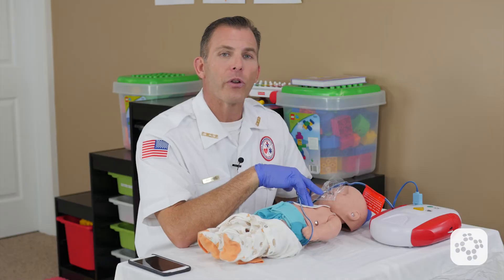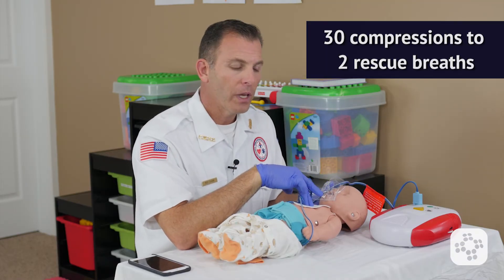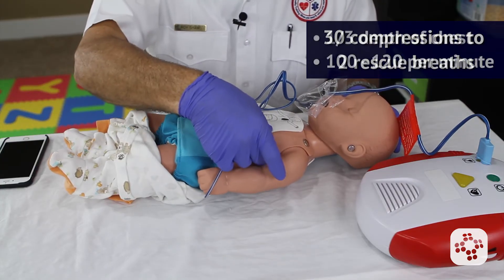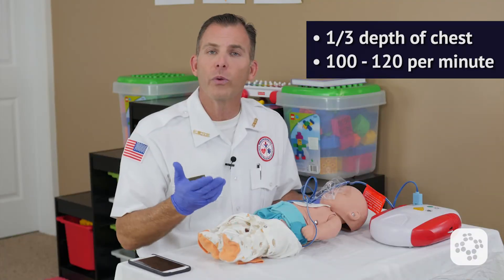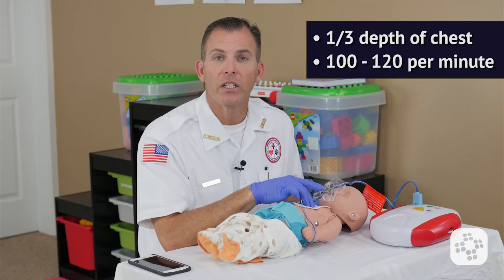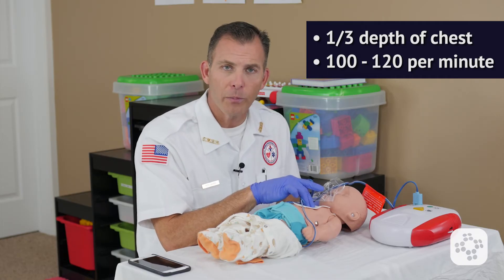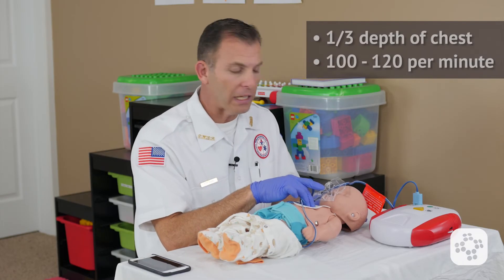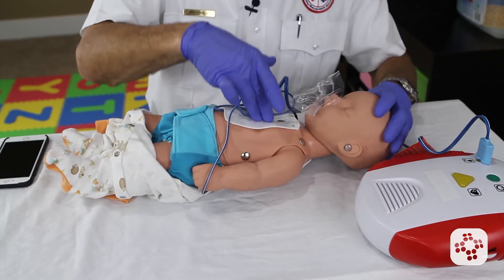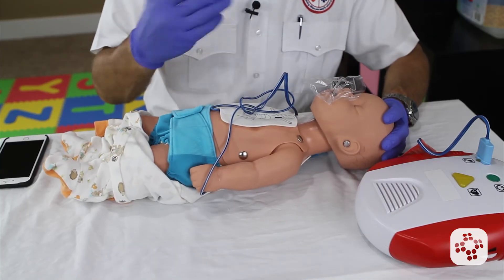We begin with thirty compressions followed by two rescue breaths, following the same CPR guidelines: compressing a third of the depth of the chest, or approximately one to one and a half inches deep, at a rate of at least one hundred compressions per minute and no more than one hundred and twenty per minute, which is about two per second. One and two and three and four and five and six and seven, eight, nine and ten, eleven and twelve, thirteen and fourteen and fifteen — all the way up to thirty compressions.